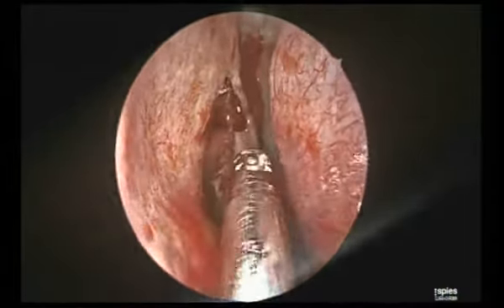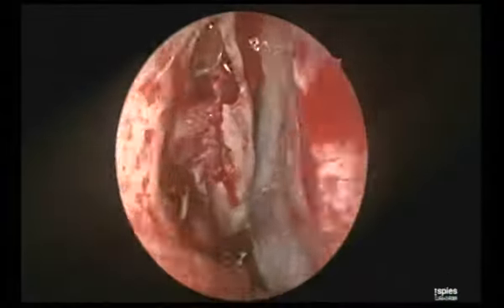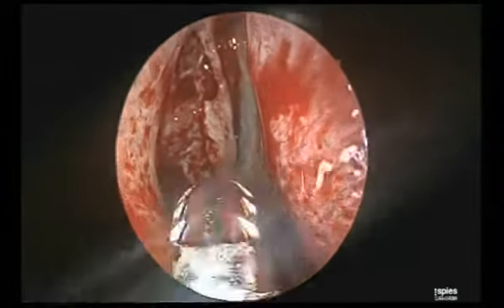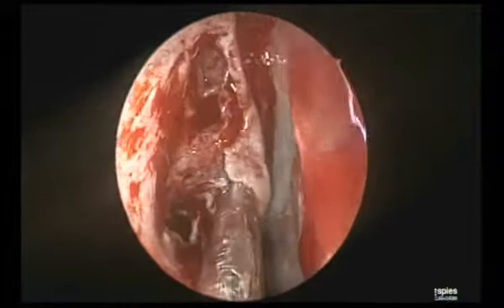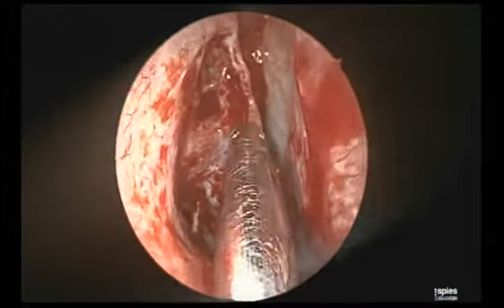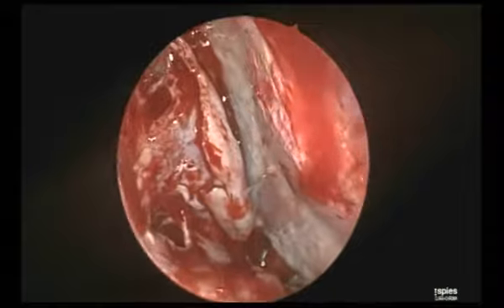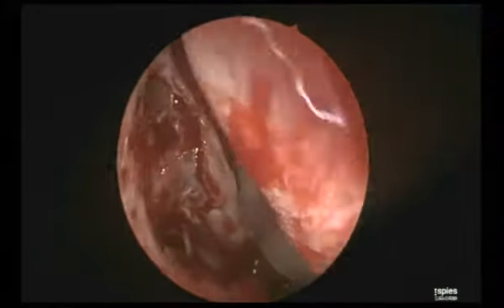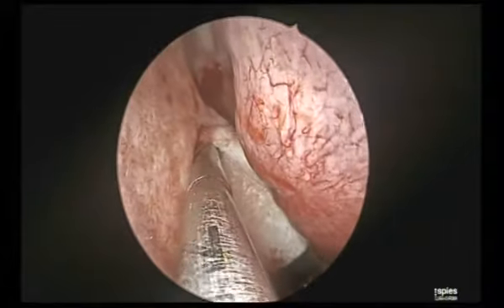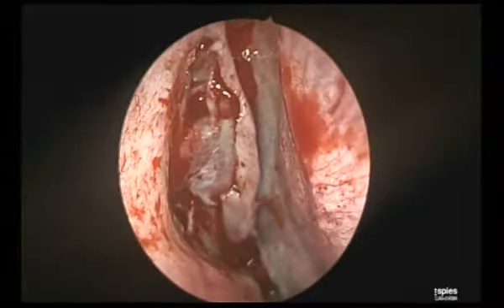See, I will keep the anatomy of the turbinate intact for future identification as well. Most of the turbinate remains. This window I have created. See this? This will prevent this turbinate falling laterally and blocking the ethmoidal access in the future for our irrigation. Now, can you believe it can block? Satish, can you believe now? Can it block now? No. It is trimmed to the extent without causing any problem at the same time. See this? It cannot give any problem.